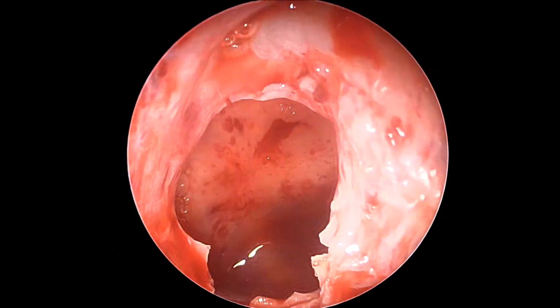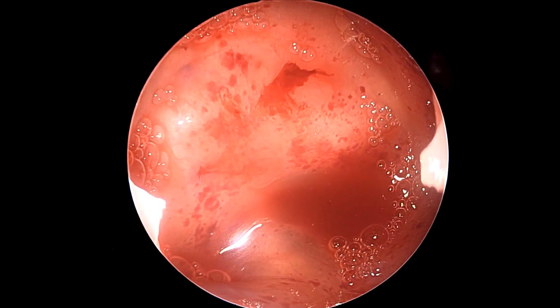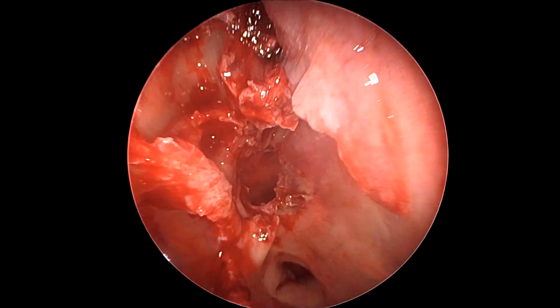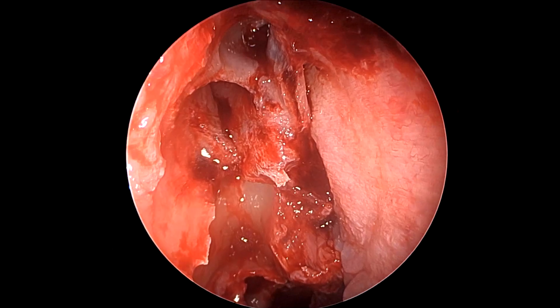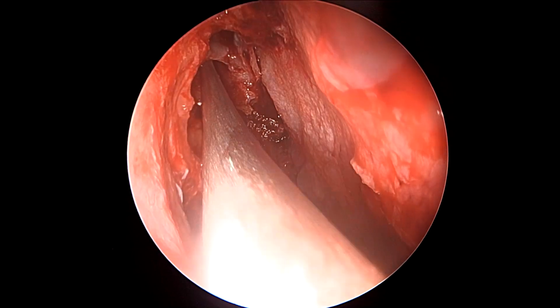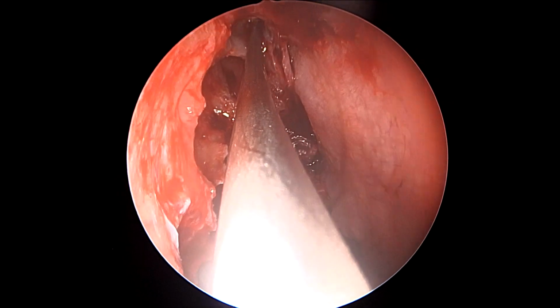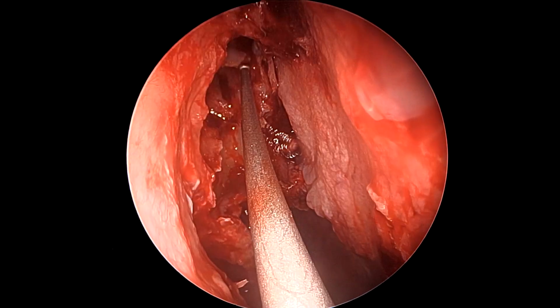There's the right side again being examined, right side sphenoid sinus with the sella turcica in the picture. Not much polyposis here. So our sphenoid sinus opening seems to be at least adequate on this side. The ethmoidectomy cavity is complete. We can see the frontal recess laterally, and like this, there's now the entry into the frontal sinus, which is clear, completely intact mucosa, and the interfrontal sinus septal cell anteriorly and medially, which goes towards the septum. You can see how clearly one can differentiate these two cells.